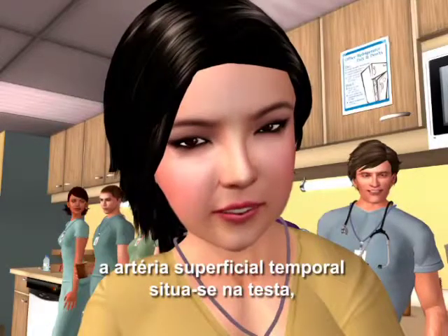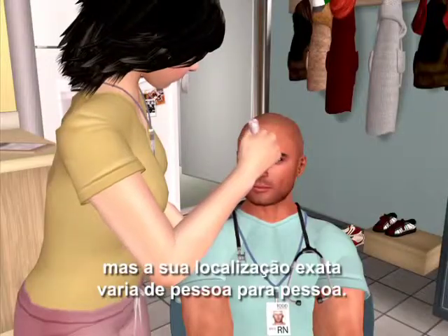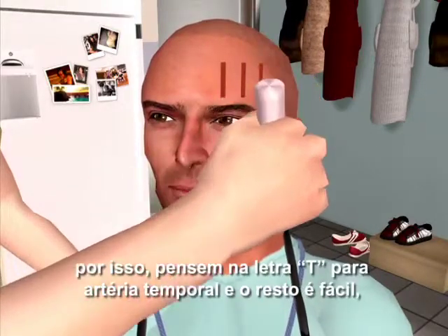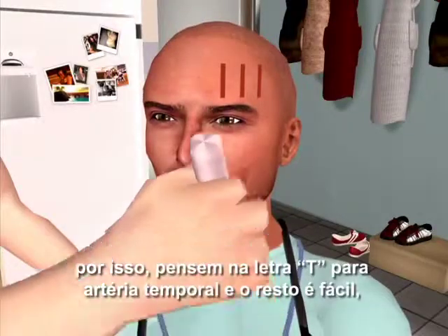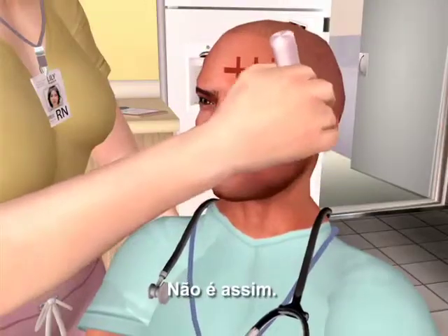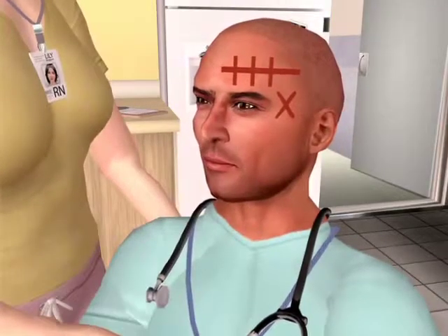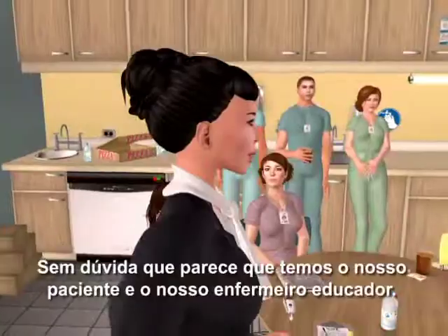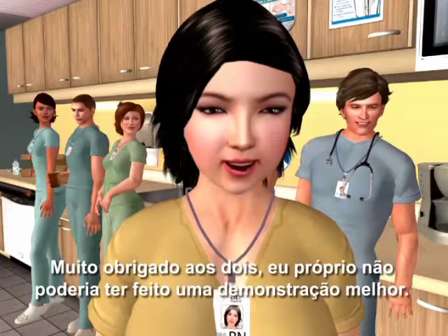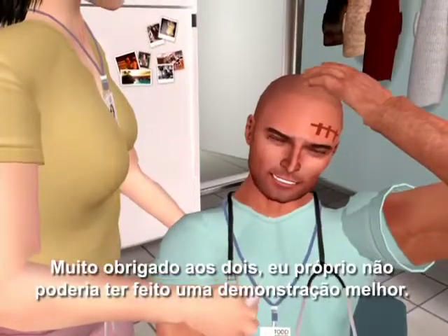The superficial temporal artery is up in the forehead, but varies in exact location from person to person. We need to cross the artery, so think T for temporal artery, and the rest is easy — just cross the T's. It certainly looks like we have our patient and our nurse educator. Thank you both; I couldn't have demonstrated it better myself.